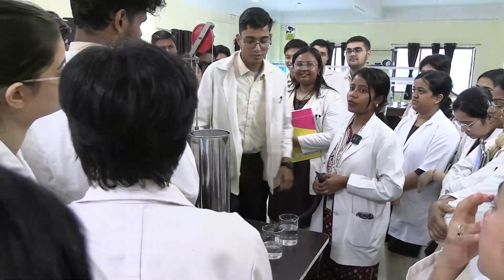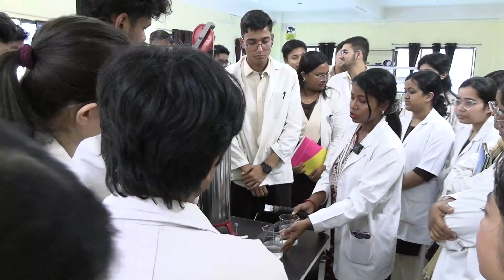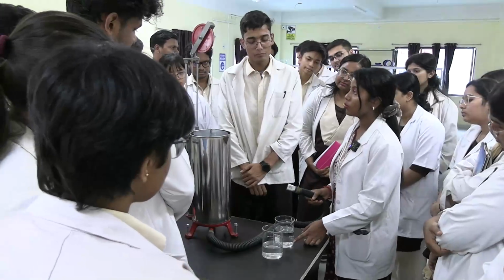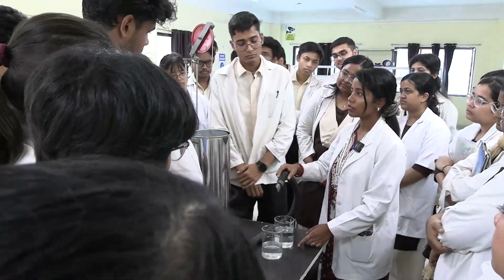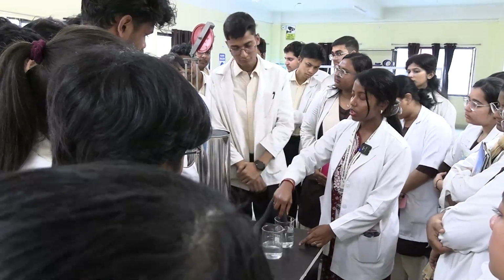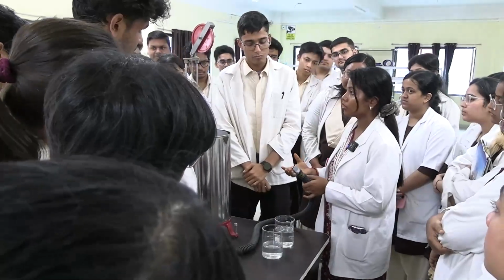Okay, so first we will be performing in standing. The mouthpiece will be kept in two types of solution: one will be antiseptic solution, one will be plain water. Before doing, you have to first sterilize it. So dip into the antiseptic solution, after that the normal water. Then if you have your hanky, or you can use cotton, to wipe it.